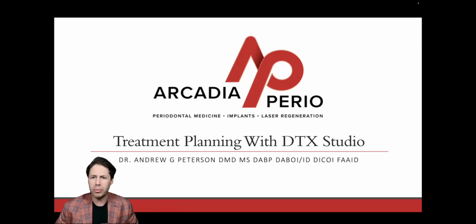Are you in need of a dental implant and wondering what that process looks like from start to finish? Well, what I've done for you today is I've created a short tutorial video about what the implant planning process is like at Arcadia Perio. So join me for the next 5 or 10 minutes and I will show you how I plan implants with the most up-to-date technology here at Arcadia Perio. So let's dive in.